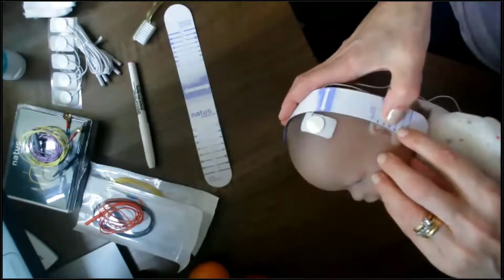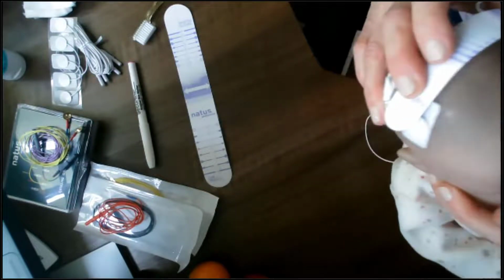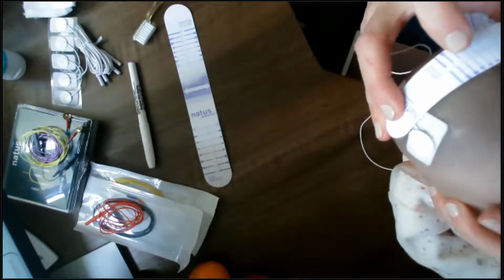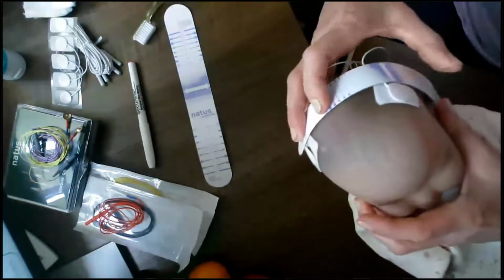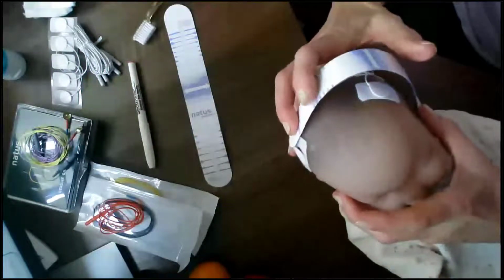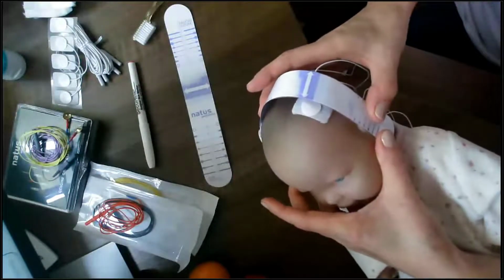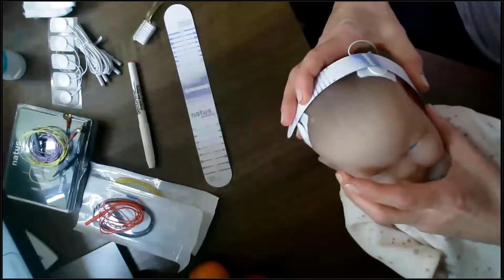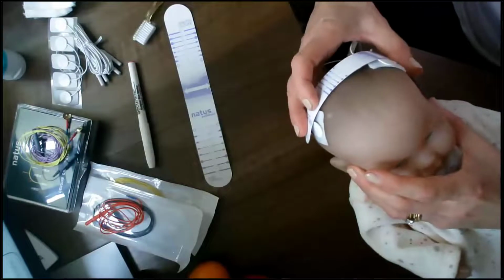So here I can see I've got the letter D at my ear tragus, and I've also got the letter D sitting at my sagittal suture. If it was a baby with a smaller head, or a bigger head even, it may be a different letter because you're going to have a different head circumference. But for this specific baby, it's actually going to be the letter D.